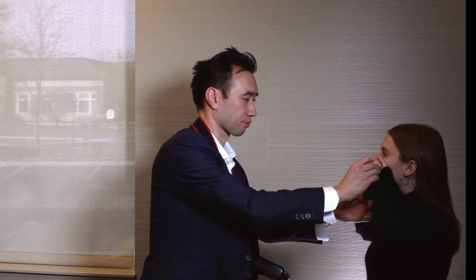The last full face photo we like to take is really useful when you're utilizing intraoral scans and completing a digital face bow. I'm going to use these lip retractors — I'll place them with the handle facing down and then rotate them in, which I find to be much more comfortable for the patient. You'll notice that Becca is taking them from behind and pushing her lips out. A lot of times patients will pull the retractors back, but in reality you want the lip retractors pulled out to pull the lips as far away as you can. I'm going to frame the picture the same way as the other full face photo — slightly above her head, slightly below — and I want to be on the same plane as her. I want to make sure her teeth are slightly apart.